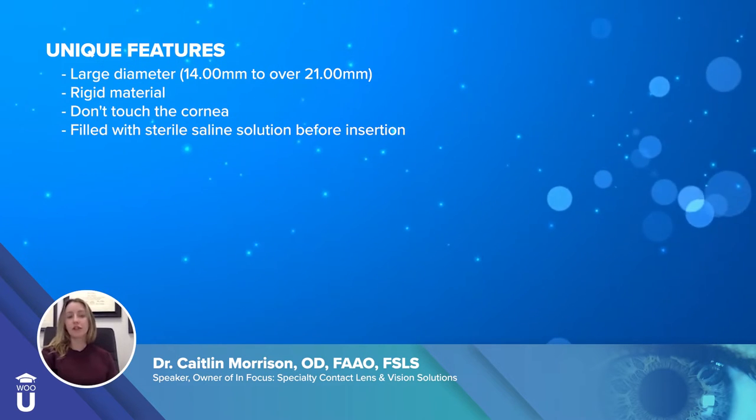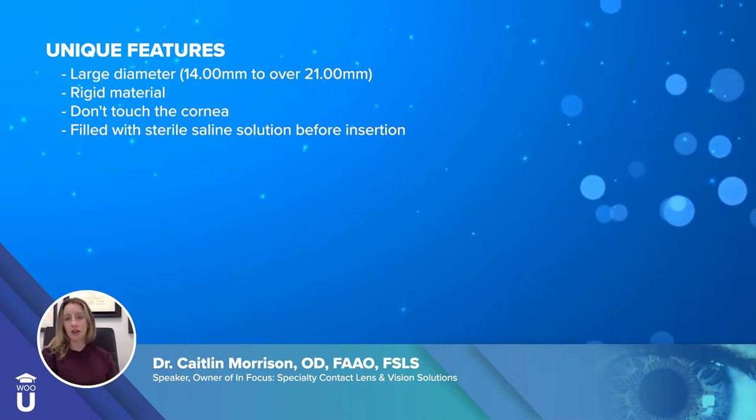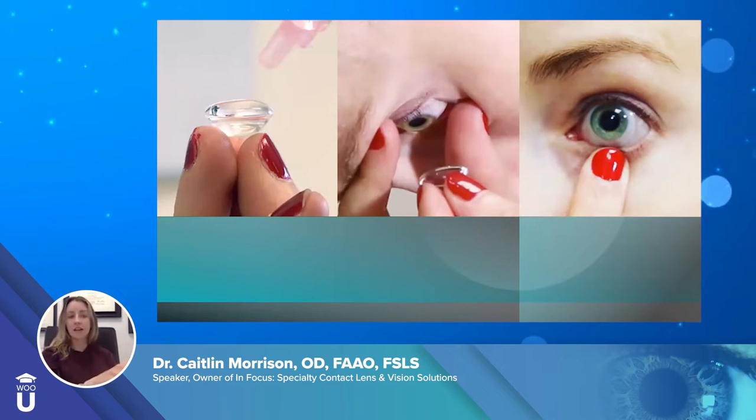Because you fill it with sterile saline, you can actually heal the eye and treat different kinds of diseases. You can see on the left-hand side, this is the scleral lens being filled with saline prior to insertion. The second image shows putting the lens on the eye — you have to tilt your head down and bring the lens up to the eye. The third shows the lens on the eye, and you can see how large it is, though when wearing it, nobody really notices it's any different than a regular contact lens.